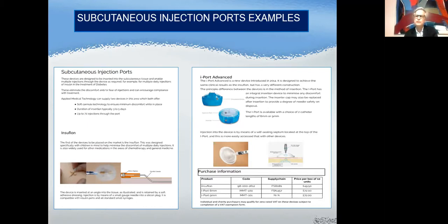We didn't want to use intramuscular, because we know that it's very painful. And I think even for parents, giving a shot every day in the muscle of their baby is very distressing. So we wanted to try this way. There were other papers in the literature telling us that in cobalamin C we could use subcutaneous administration safely, and not only safely but even in an efficacious way, working like the IM way.